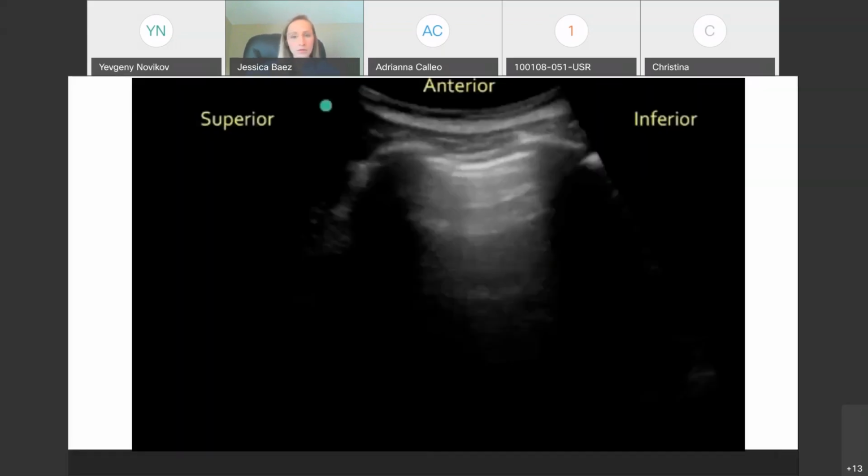So in normal lung, I mentioned earlier that you have the angle of the probe and how you're, yes, it does. So typically it's seen best in the PLAPS point that I mentioned earlier. And really the way the physics works behind it is the ultrasound likes to travel in a straight line. So you have to get a specific view with this. You won't always see it, but if you don't see it, you should at least be concerned and look for secondary findings of pleural effusion, like the spine sign or something like that. Good point.